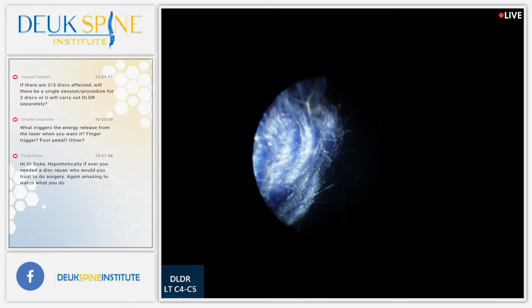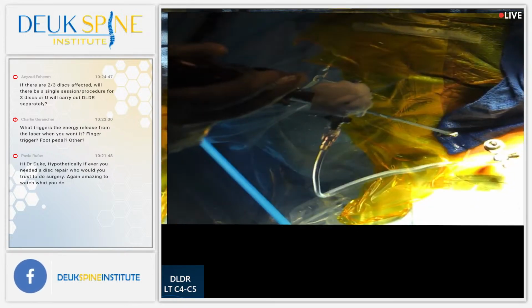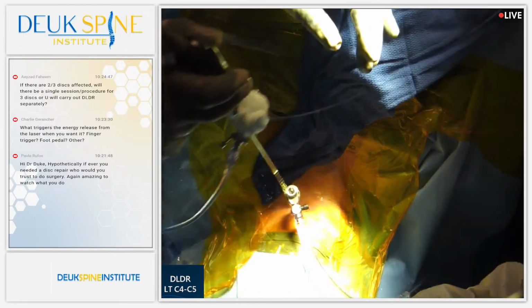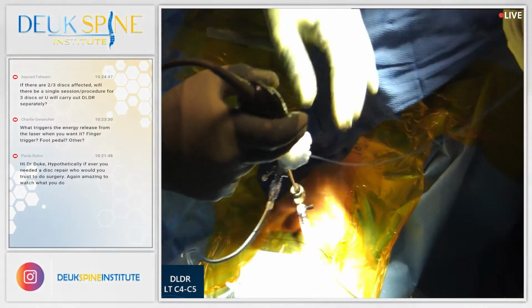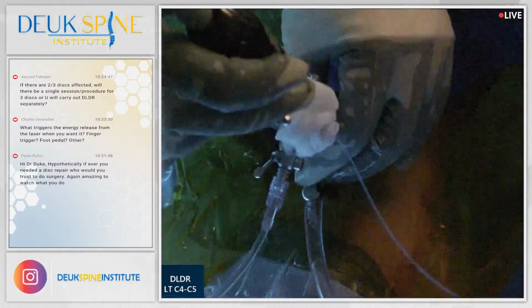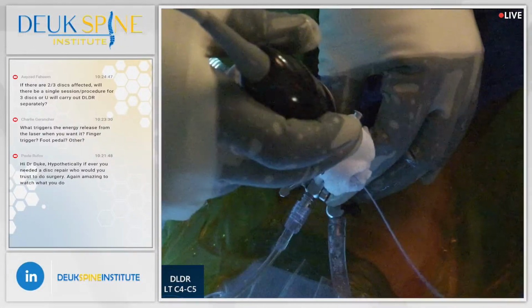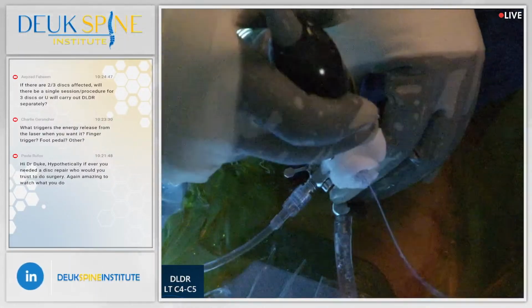You have about 5 minutes? No, I'm done. Oh, that was a big herniation. I'm pretty much done. Okay. I've peeled away as much as I can safely off the spinal cord. I've gotten rid of all the other loose herniations. I'm just taking one more look because sometimes you look away and there's something else that just pops out of there. This is another piece of herniation.